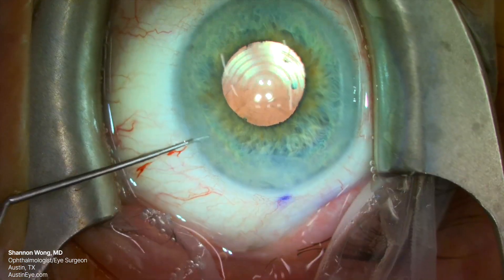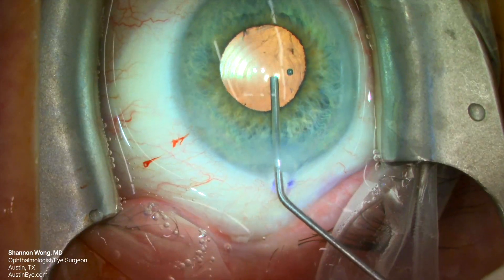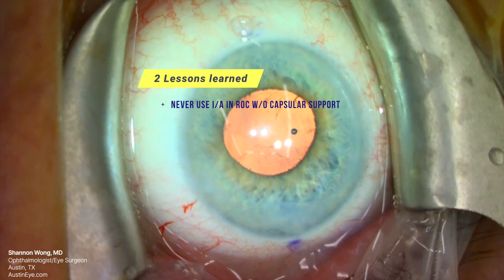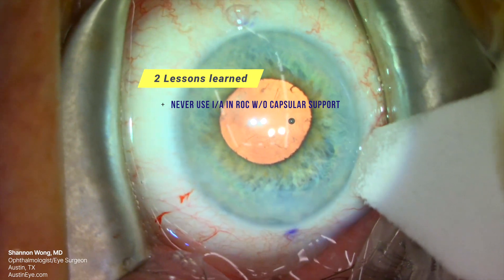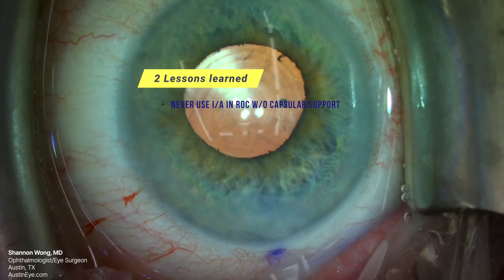The PanOptix is perfectly centered in reverse optic capture configuration. Two lessons learned. Number one: never use irrigation and aspiration to remove viscoelastic if the IOL is in reverse optic capture in the absence of a posterior capsule. Just use BSS on syringes.